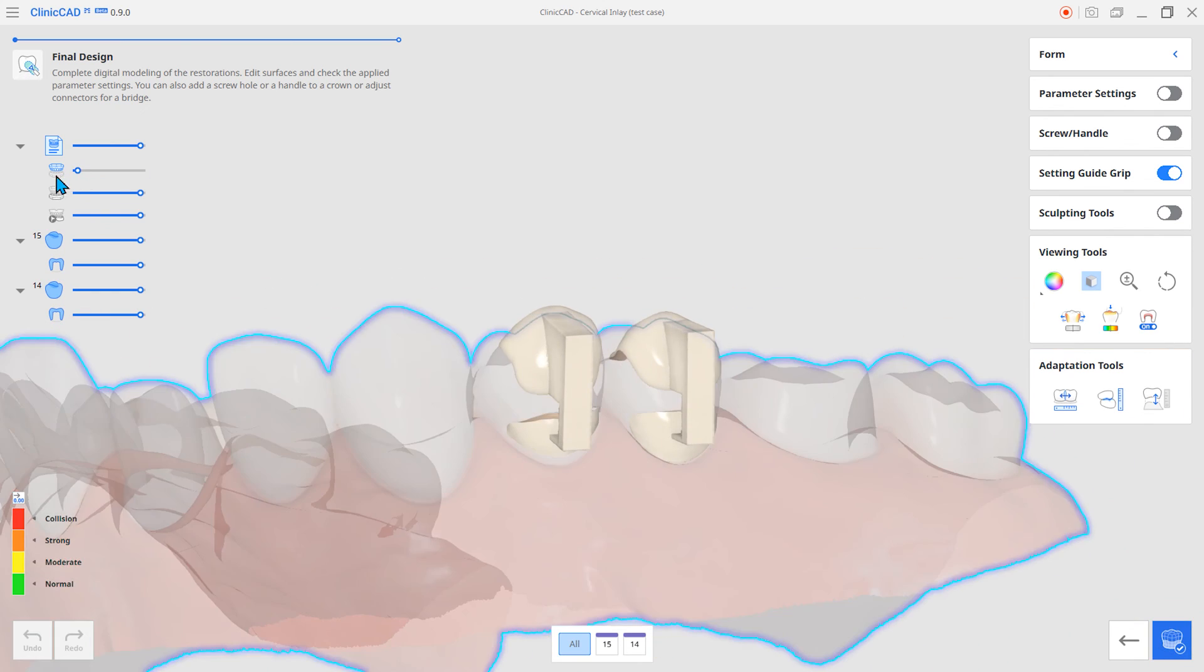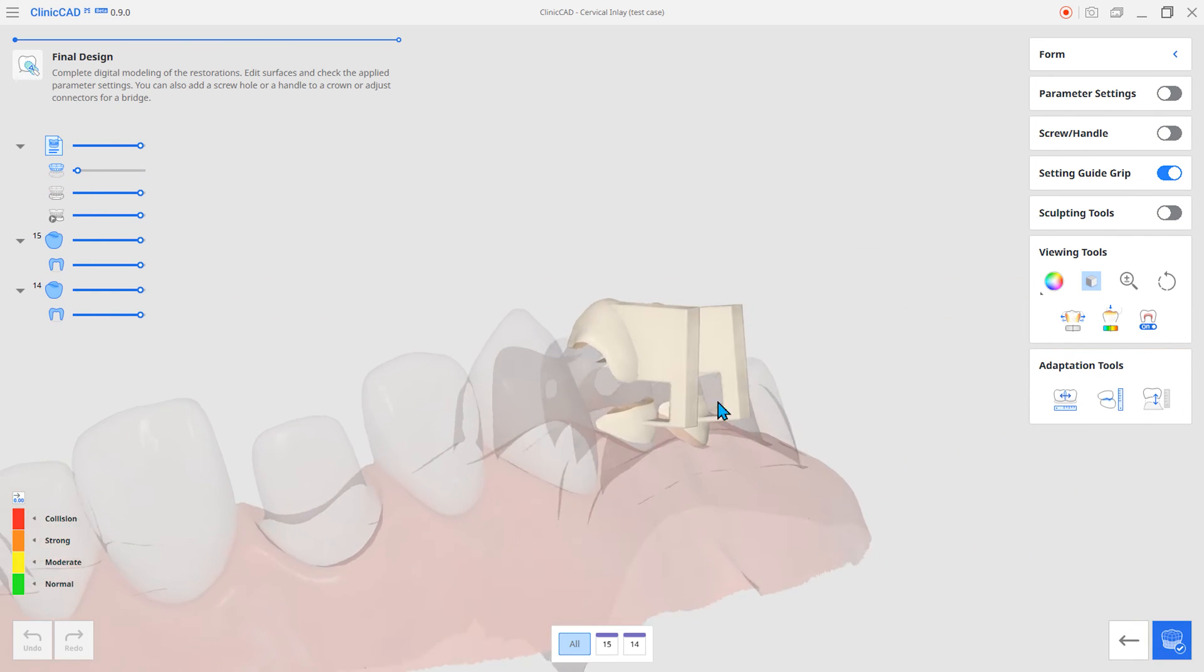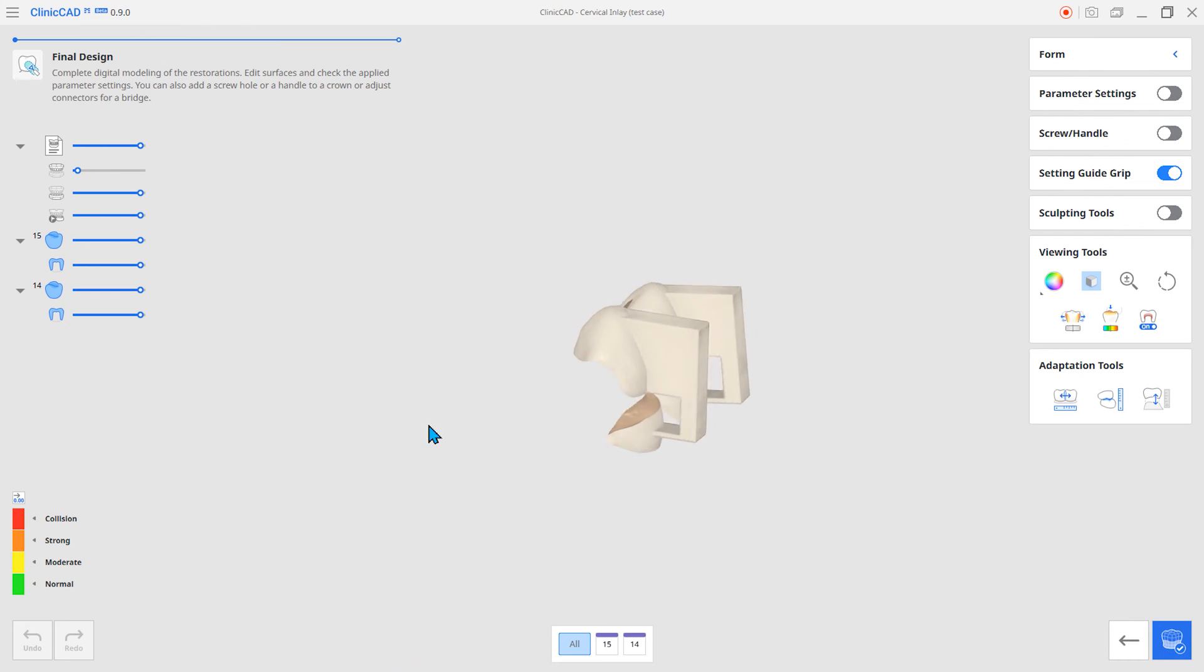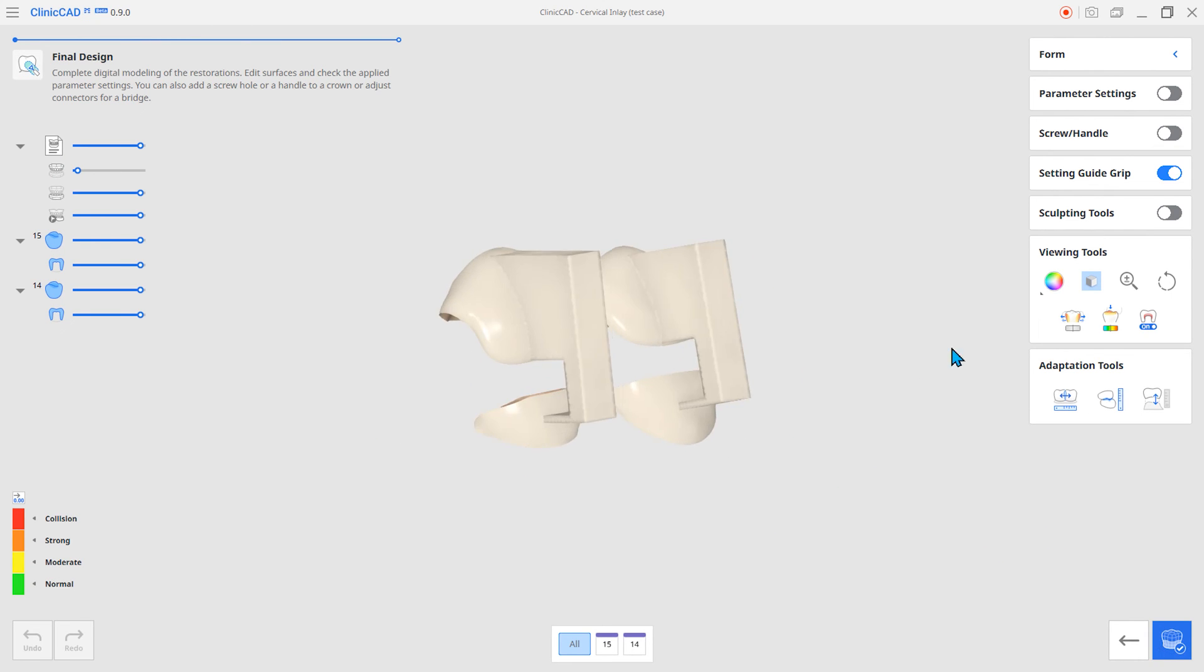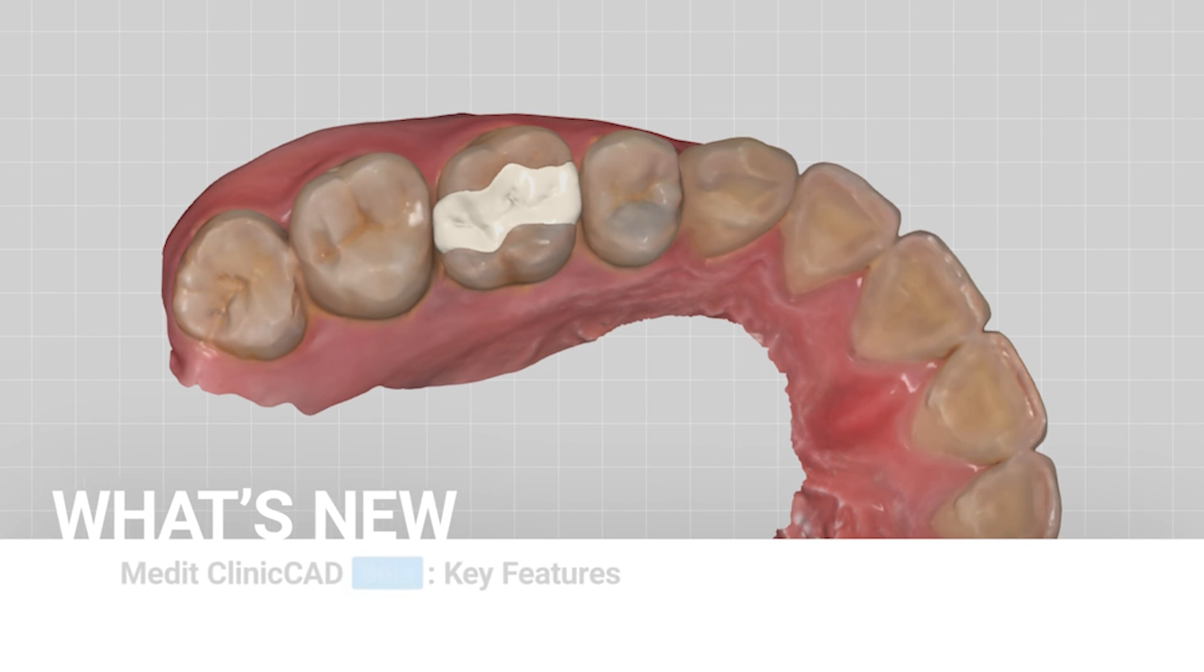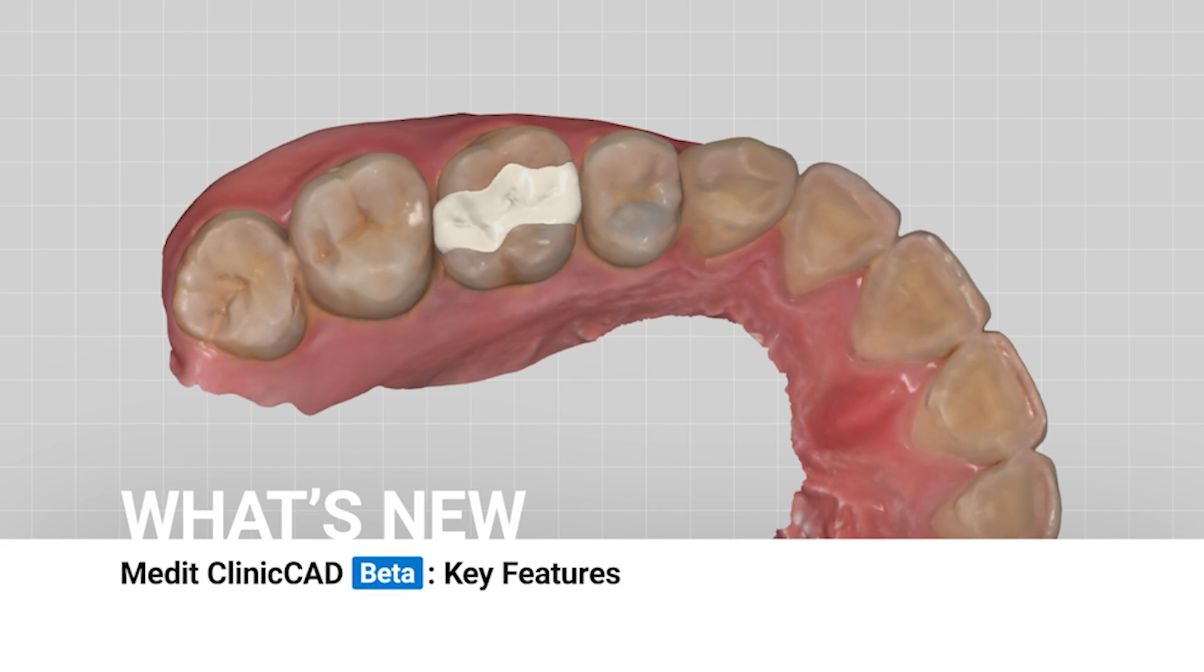It can be attached more securely than resin fill-in and has less discoloration over time. These are the main features of the new Medit ClinicCAD.